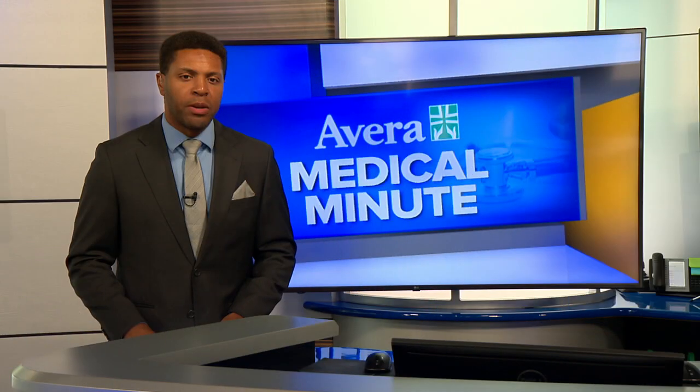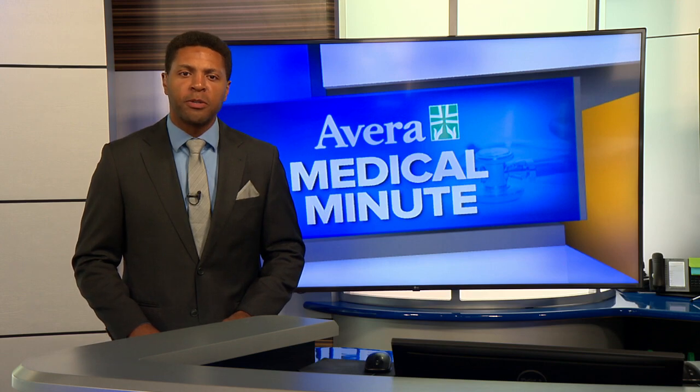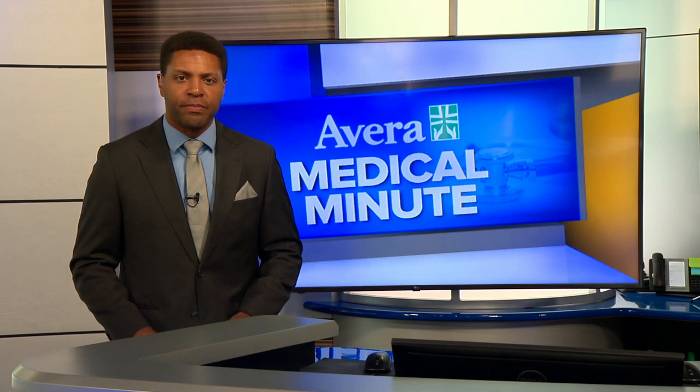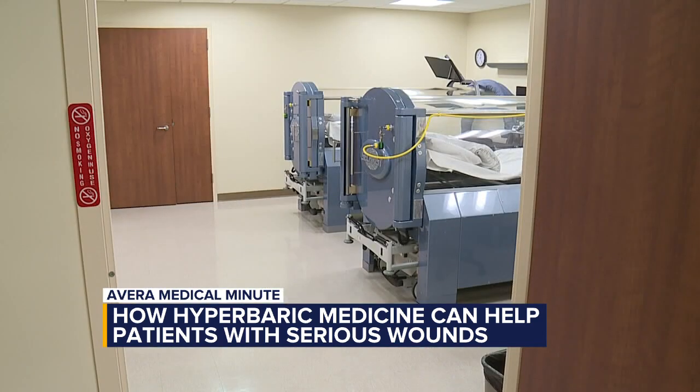A long-standing treatment is receiving new interest from patients who have stubborn wounds that just don't seem to heal. Brian Allen speaks with Dr. Christopher Auvenshine about the benefits of hyperbaric medicine. Hyperbaric oxygen therapy is the application of oxygen as a medication in a high-pressure environment.